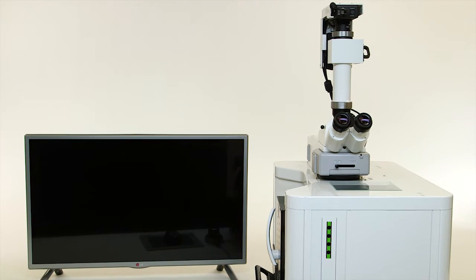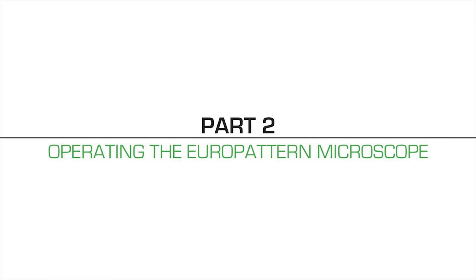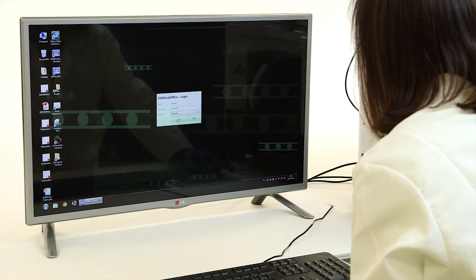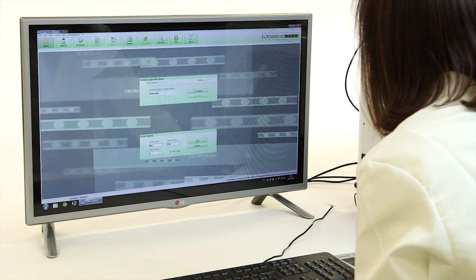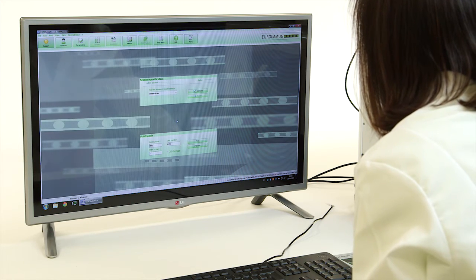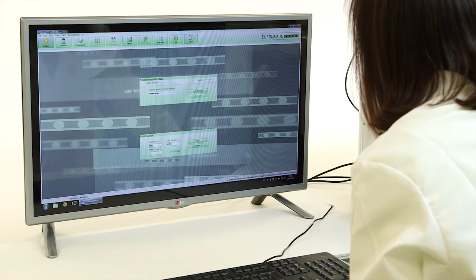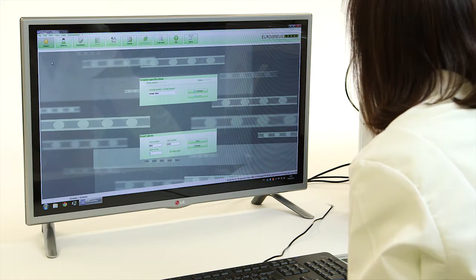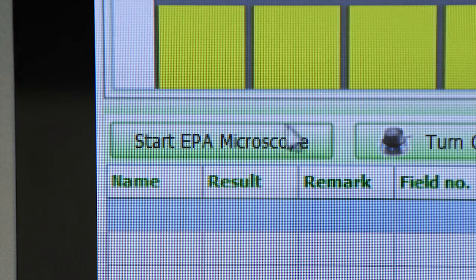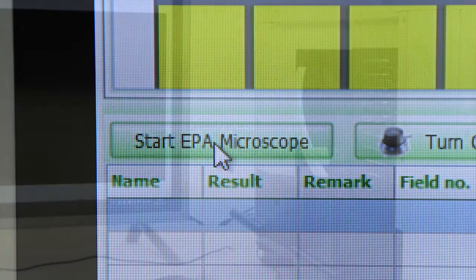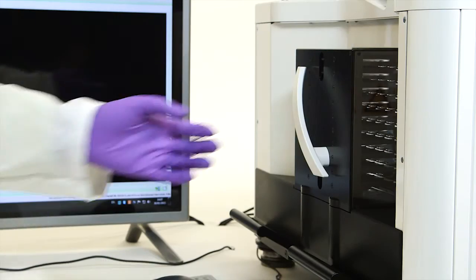Let's begin the demonstration. At the PC, start EuroLab Office and select Activate to start the required session. Then, click the Start EPA Microscope button.